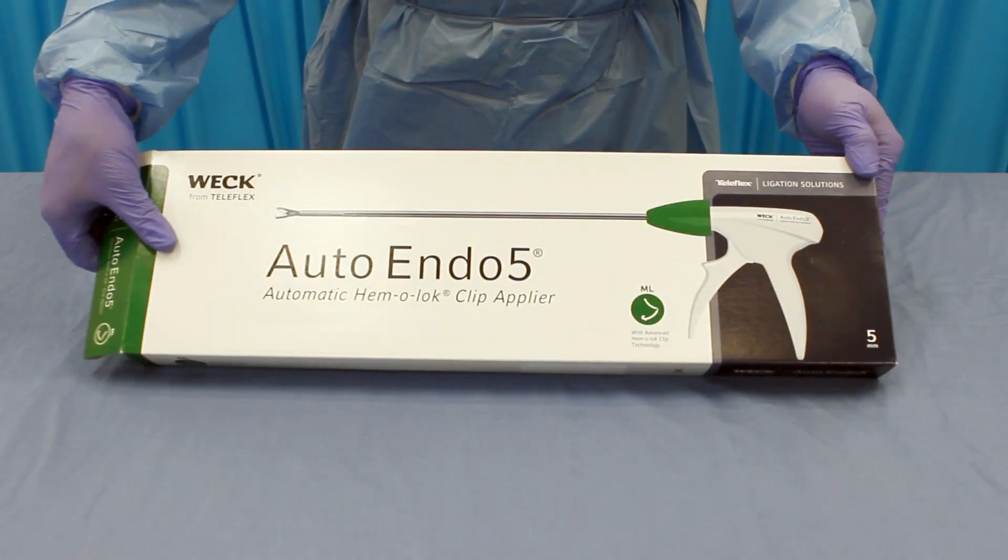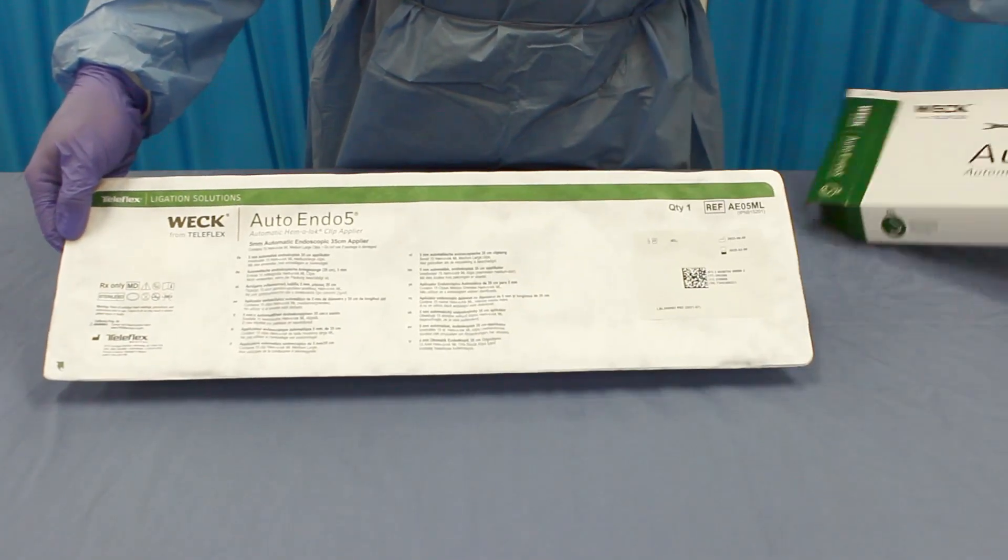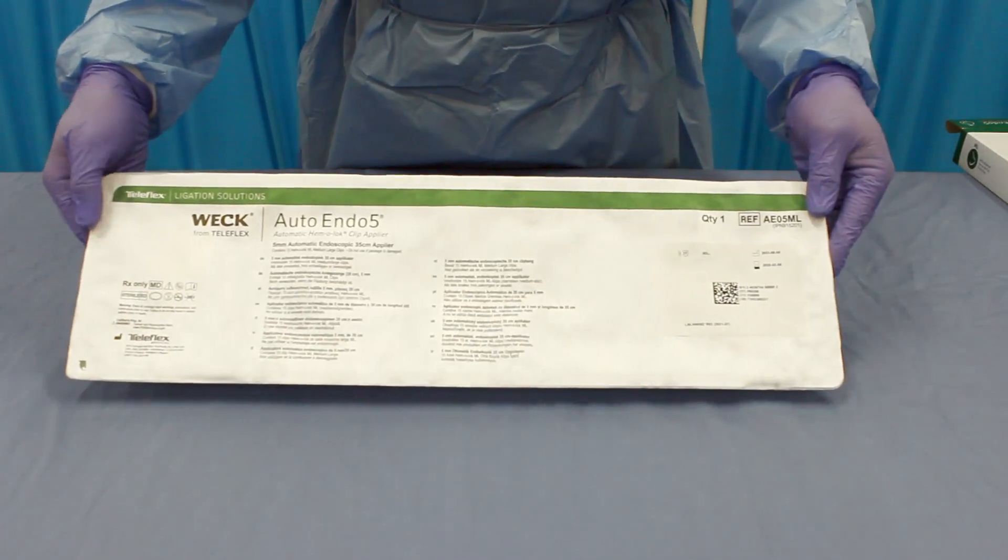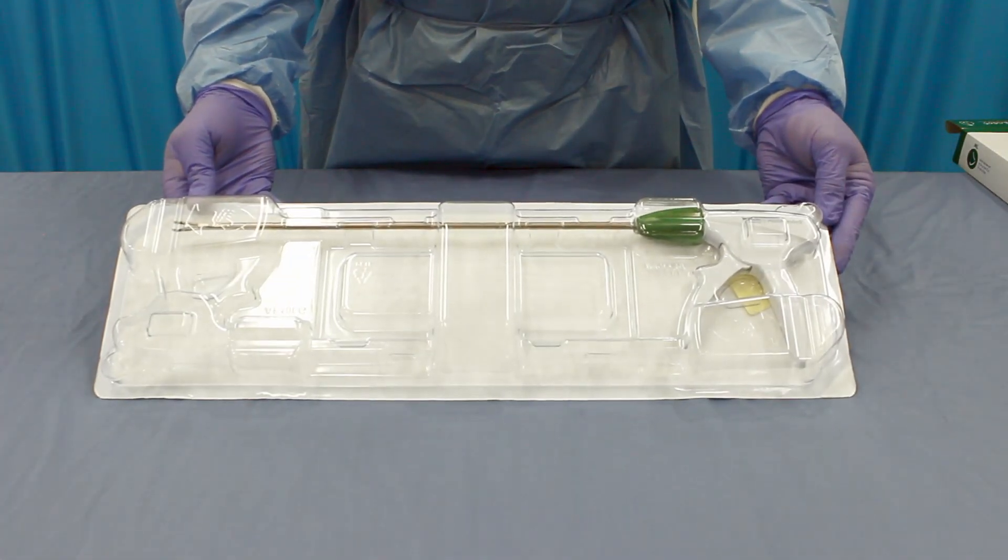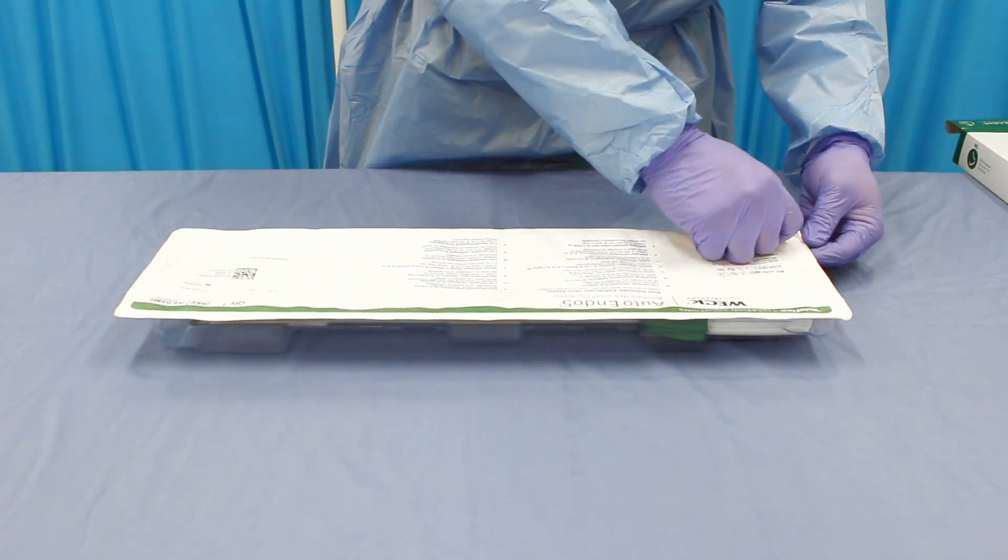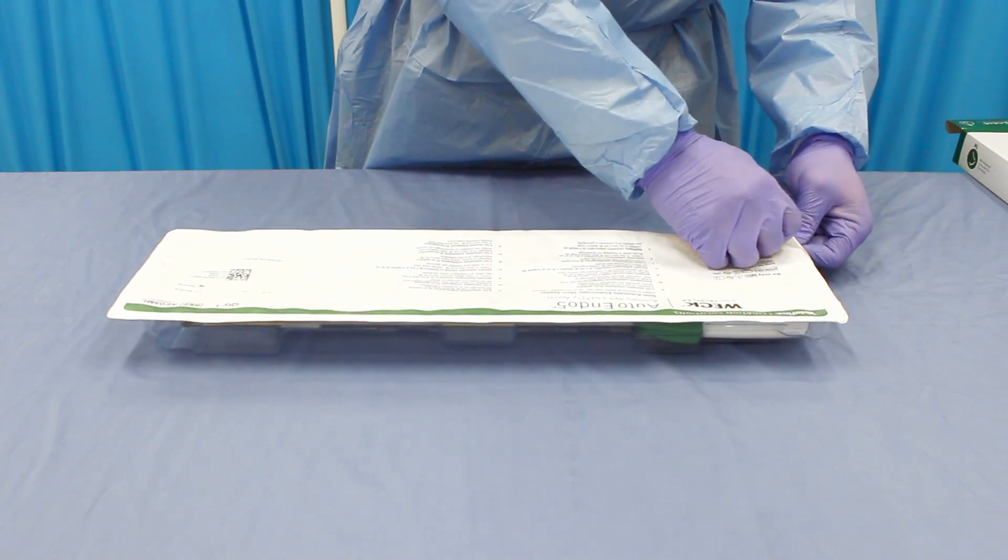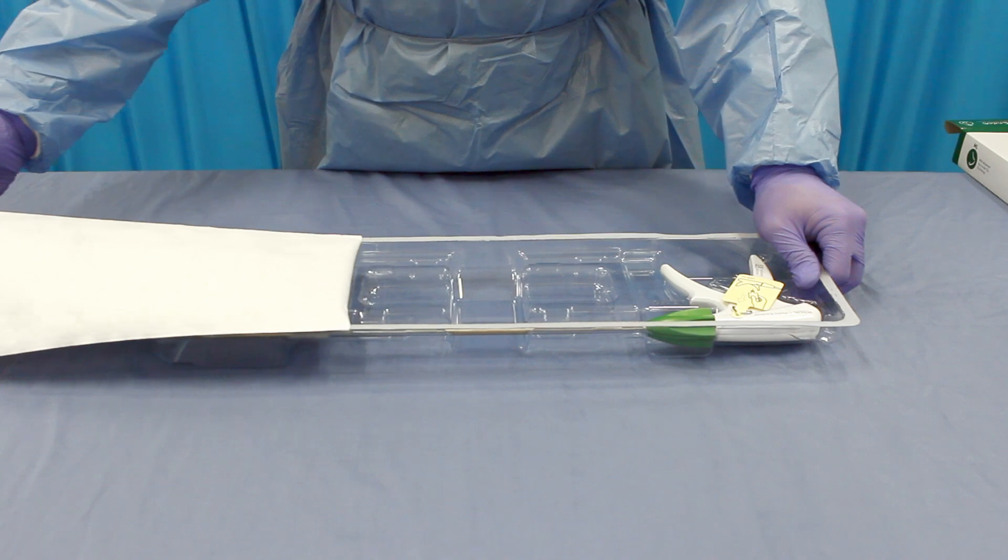The Weck Auto Endo 5 Automatic Hemolock Clip Applier provides ligation confidence and security in an automated delivery platform that is designed for procedural convenience and flexibility. It comes packaged in a Tyvex sealed tray and is indicated for single use. The 35 cm shaft contains 15 medium-large Hemolock Clips. The applier's extended length enhances reach and procedural flexibility.